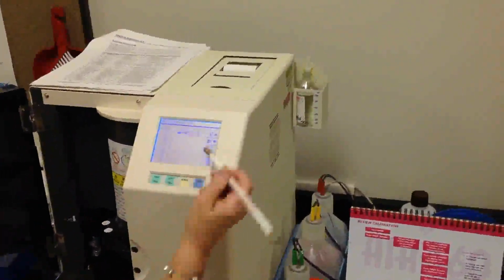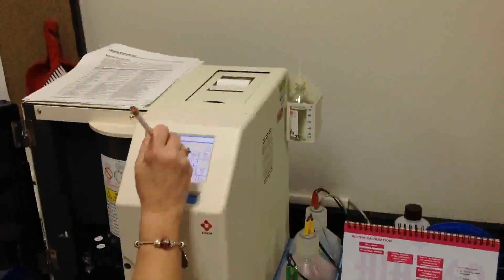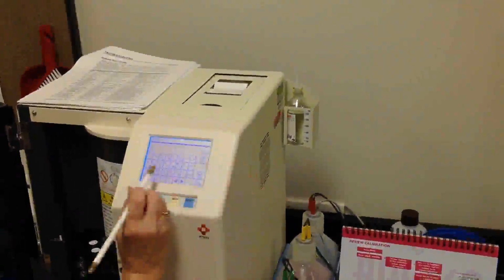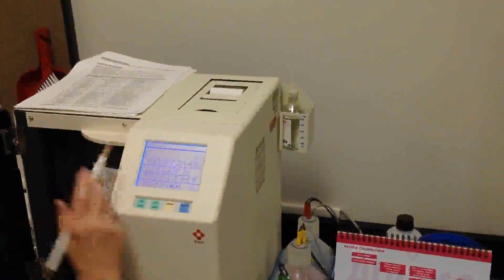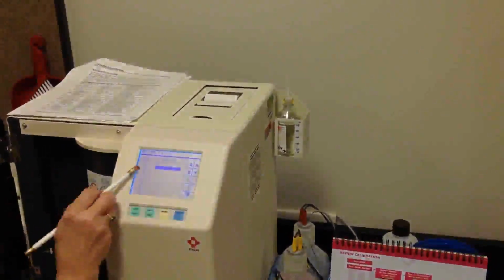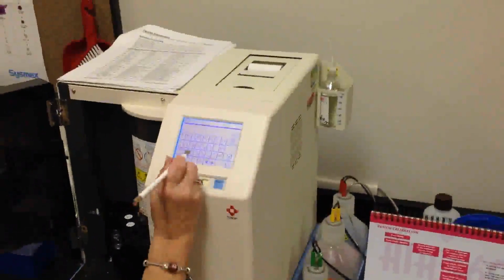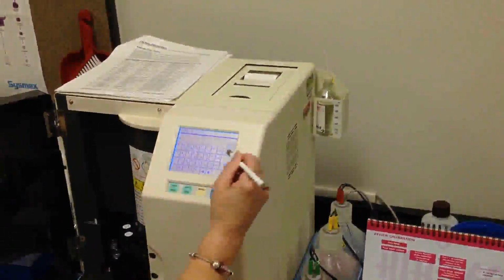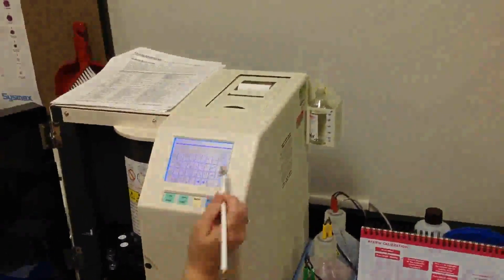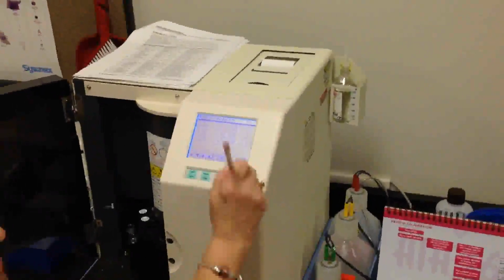modify, ABC, Q, C, go to mode numbers, 1, QC1, okay, and drop down to the next sample position, modify, I want the alphabet, Q, C, modify to numbers, 3, okay, exit, and I'm ready to start.